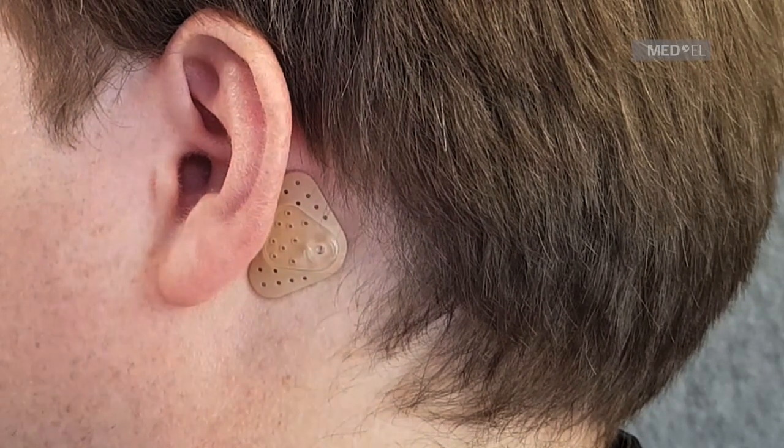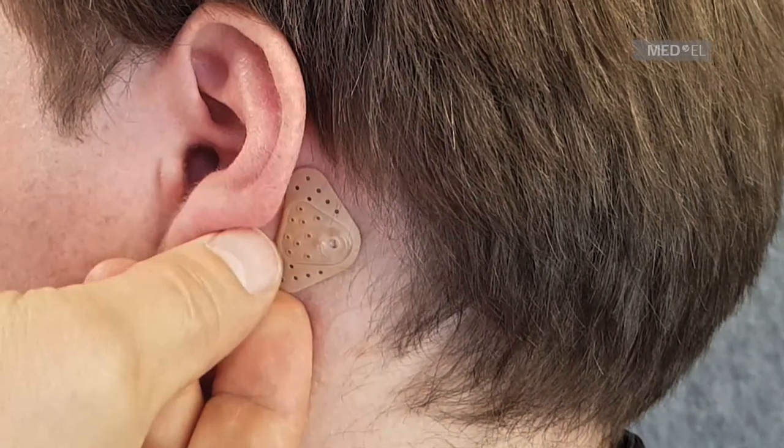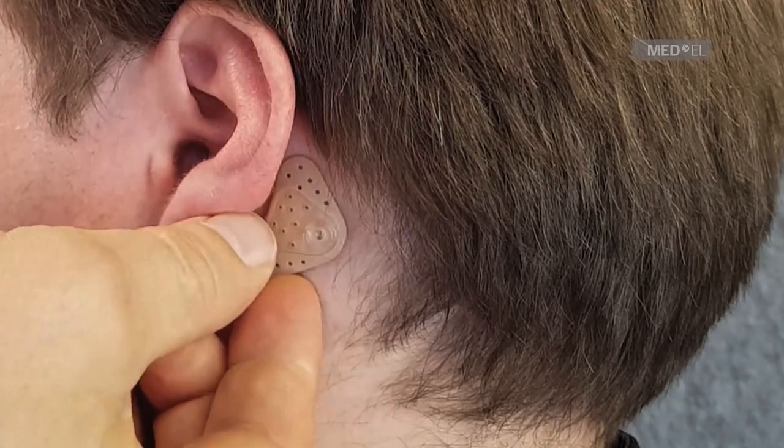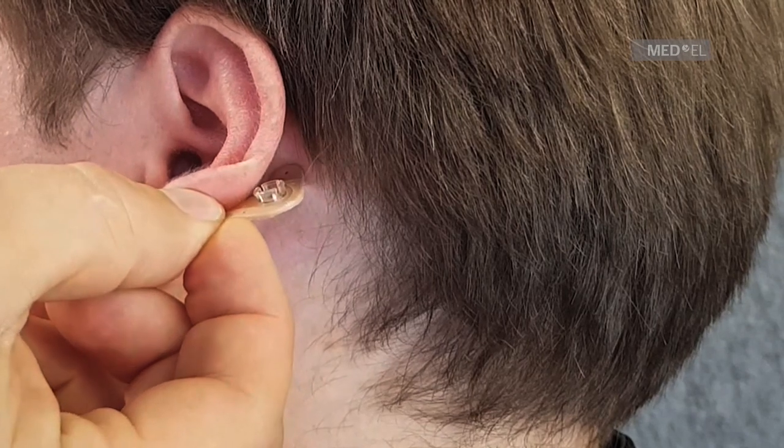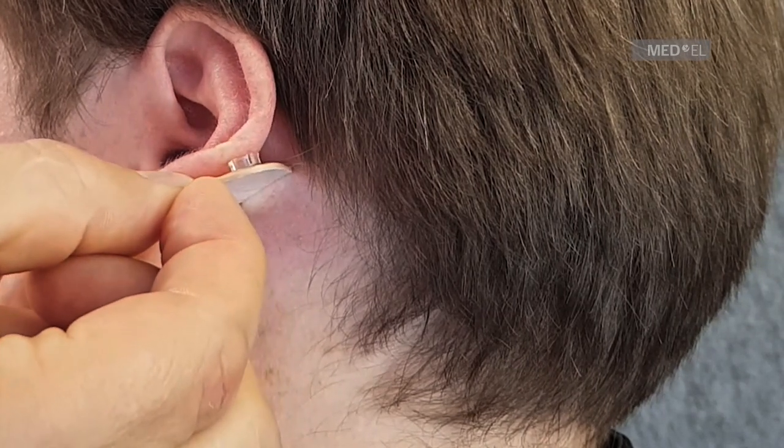The adhesive adapter can usually be worn day and night and should be changed once or twice a week. Remove the adhesive adapter by slowly peeling it off the skin. The adhesive adapter can only be used once.